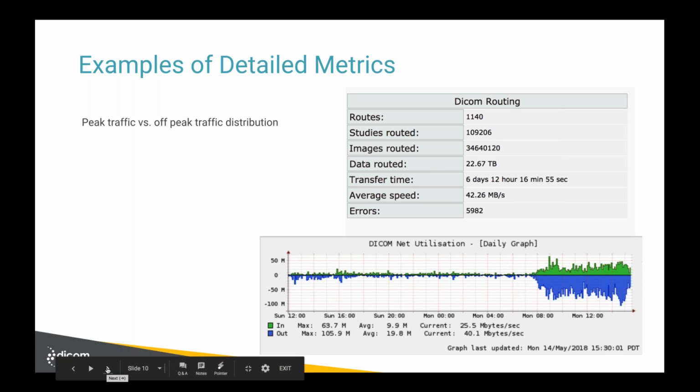So by looking at this, we can conclude that the limitation is probably not the disk. You have a 1 gig network somewhere that is the limitation of the outgoing maximum speed here, because we're almost hitting the 1 gig limit for the network. And I assume, Trevor, you have a 1 gig network, right? I believe it's 10 gig actually. Yeah, but not for all the systems, I guess. So no, not the modalities connected. No. Yeah. So basically, that's how you can tell.